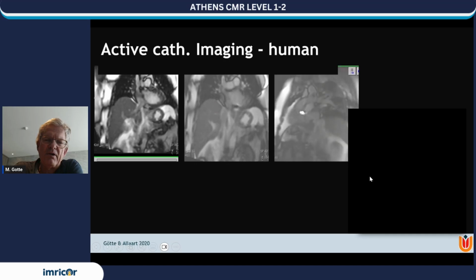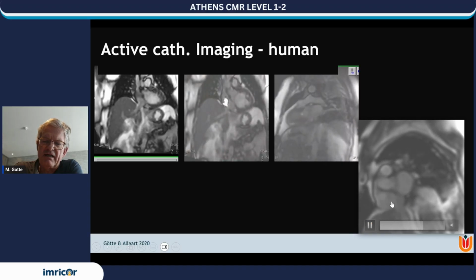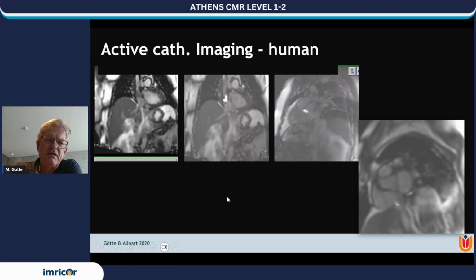And finally, we were able to advance the catheter into the coronary sinus and the second catheter for the ablation procedure in the right atrium. You can observe it over here. This is in the coronary sinus, and this is the other catheter used for the ablation.